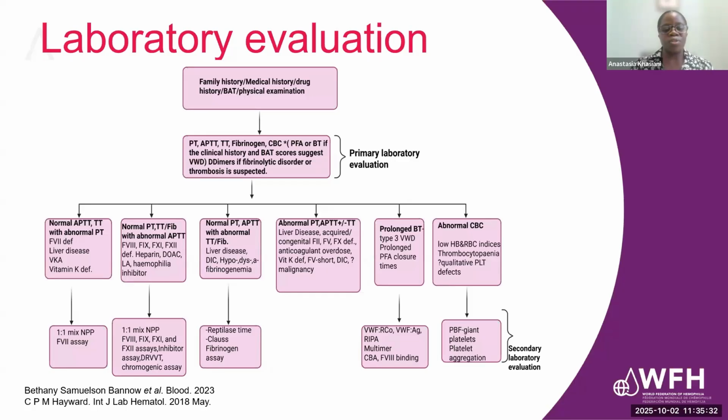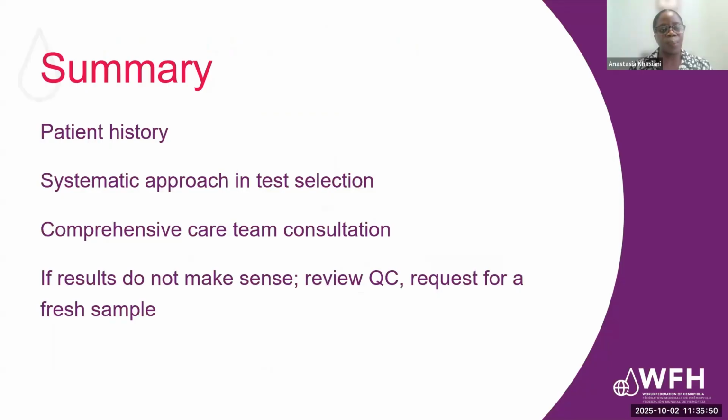So it's mainly focusing on bleeding disorders, but there are many other coagulation disorders that can be detected with different kinds of flow plans. Next slide, please.